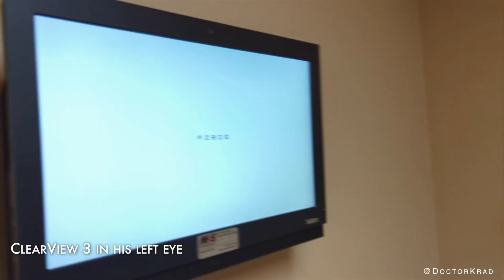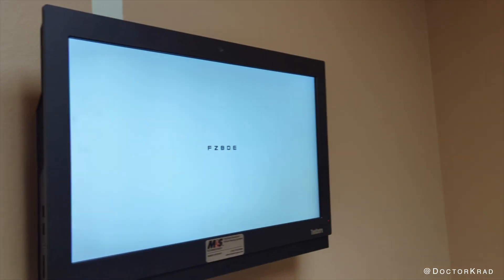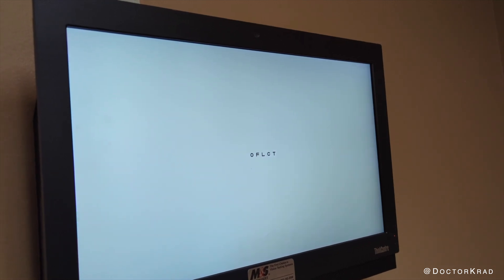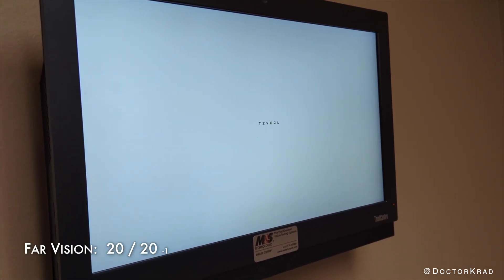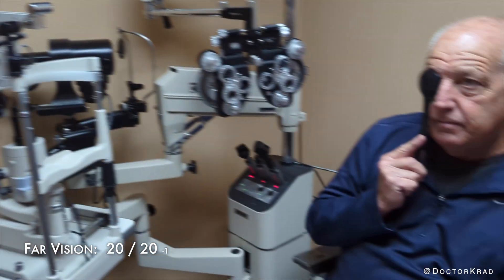Now we're going to test your far vision. We have a chart over here. Are you able to read those? Yes. Read them for me please. F-Z-B-D-E. Can you read those? O-F-L-C-T. Good job. How about these? A-B-E-O-T-F. Last line: T-Z-B-E-O-L. Very good — you got five out of six. That's fantastic. So that's 20/20.